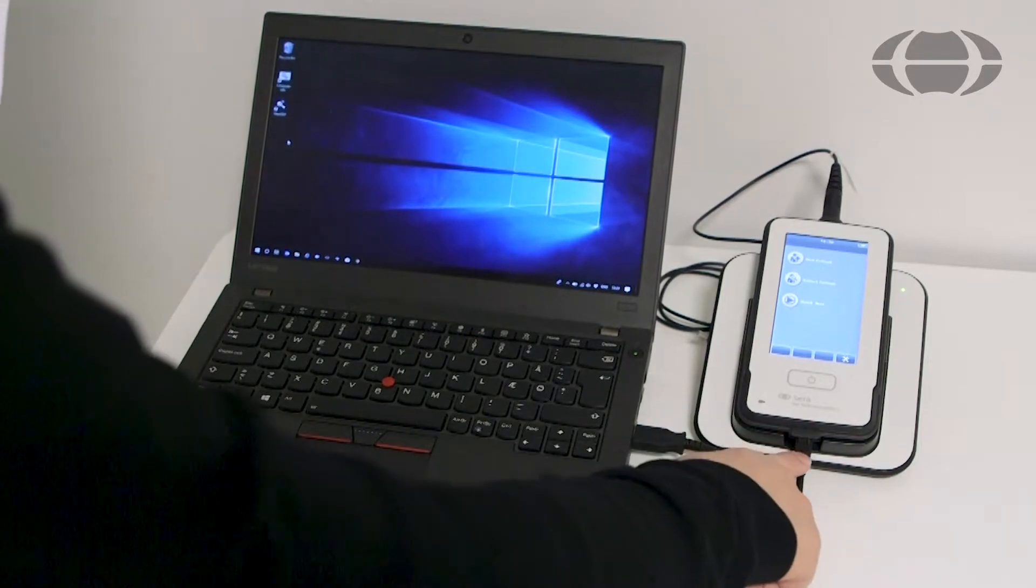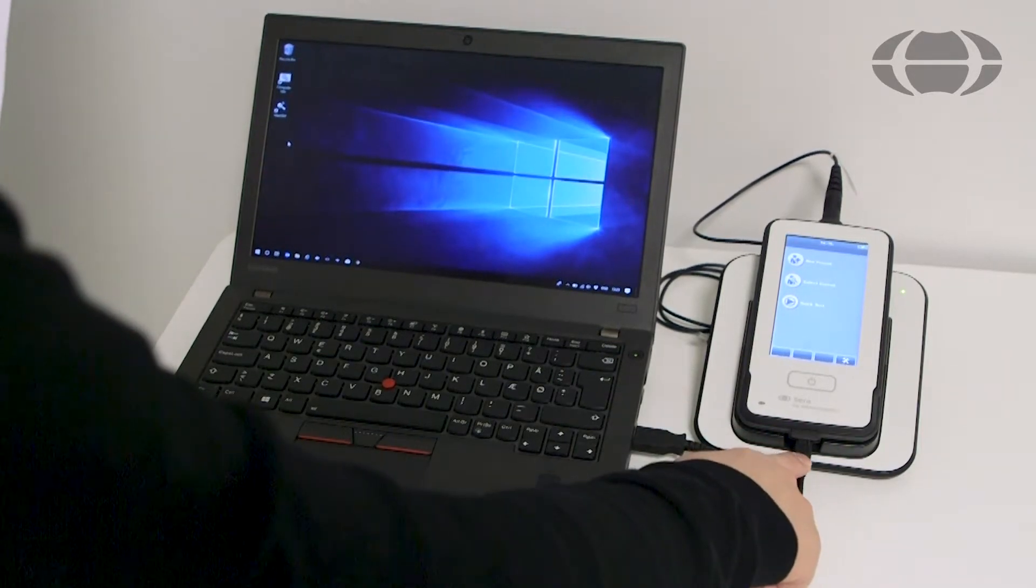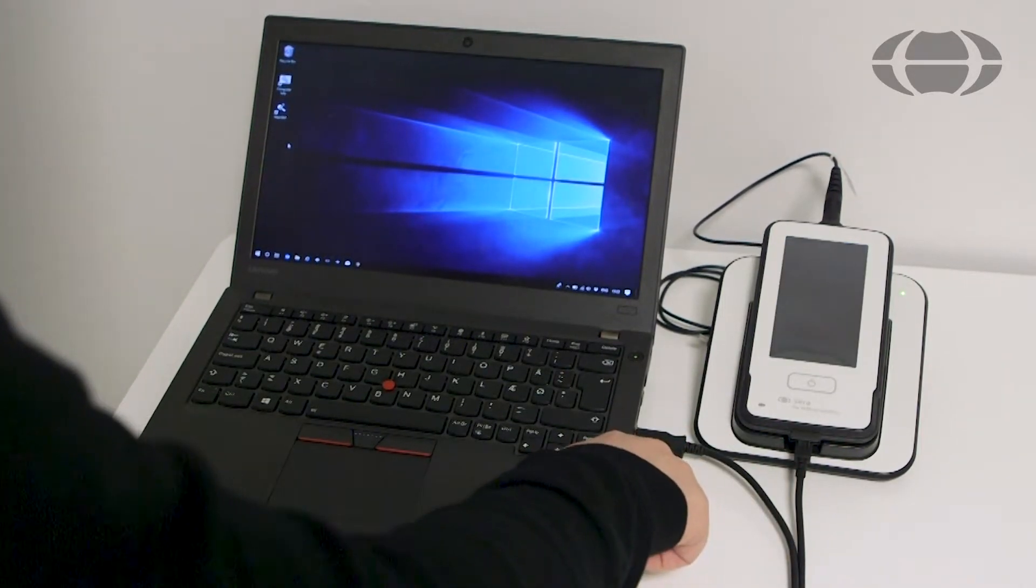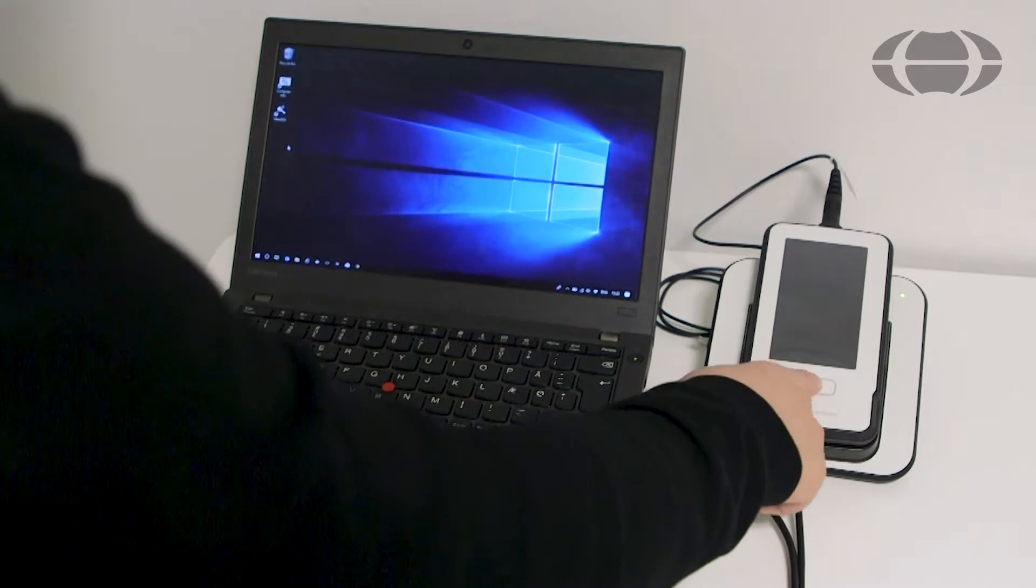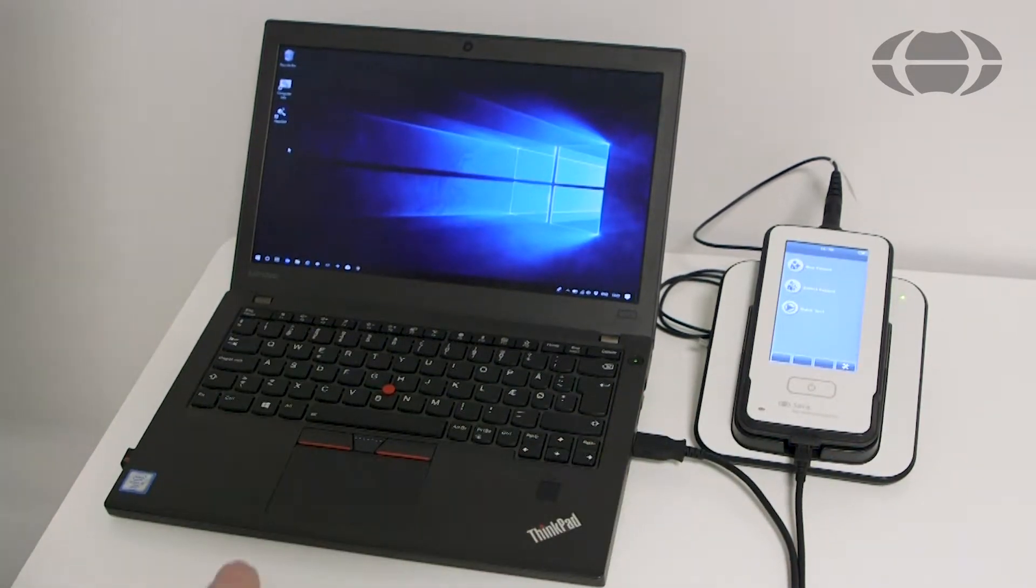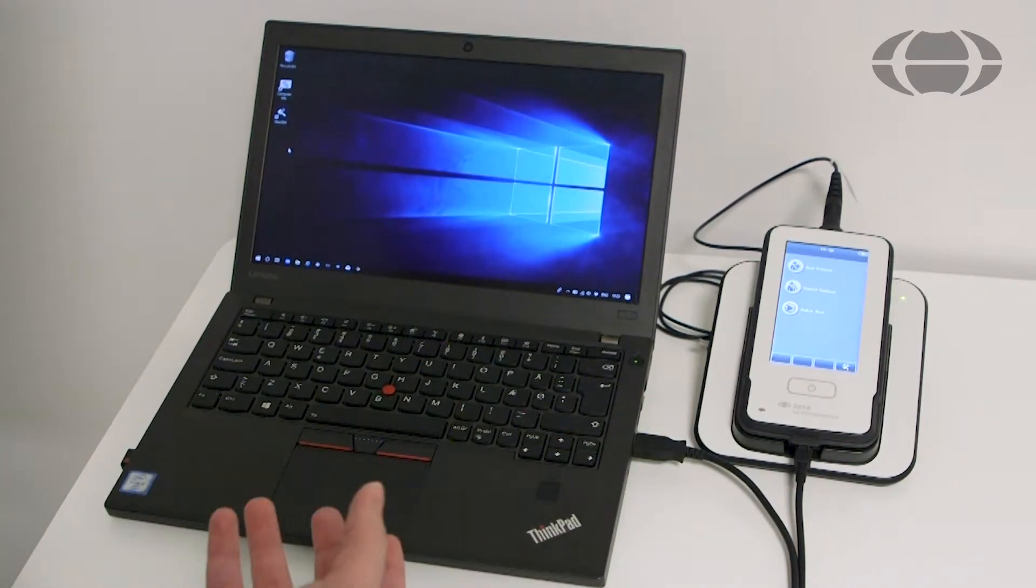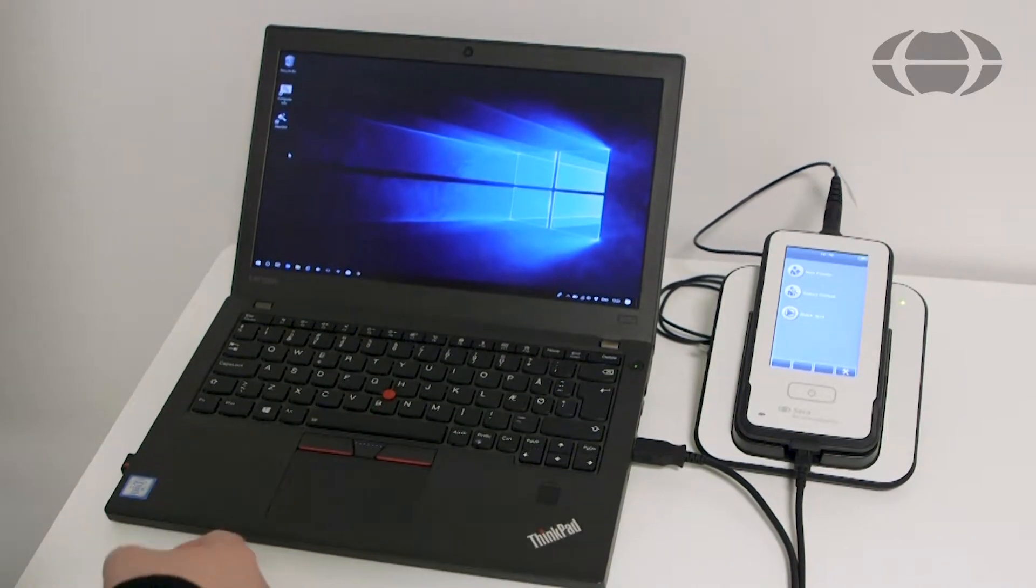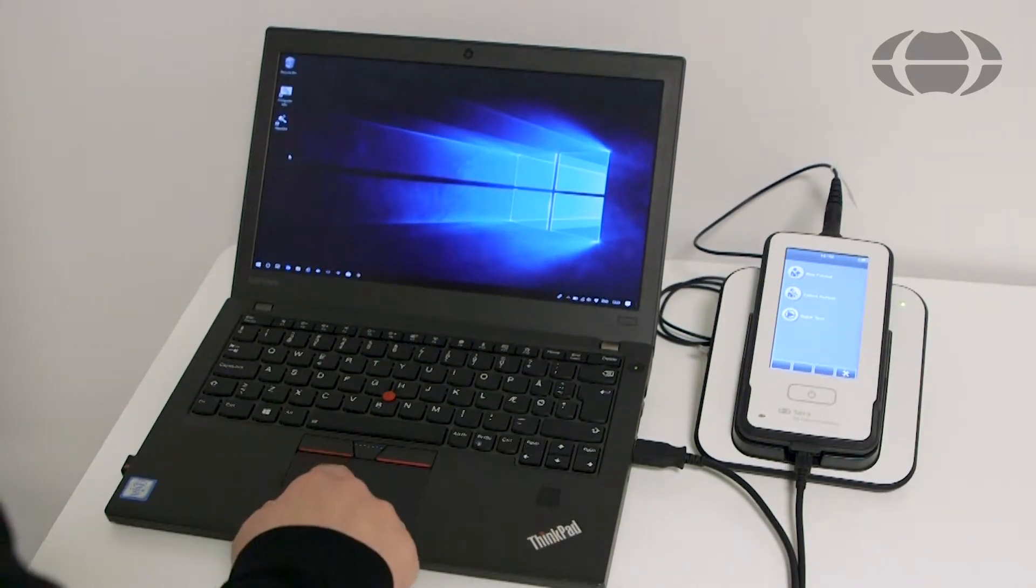Connect the USB cable to both the Sarah and the PC. Ensure that the Sarah is switched on and on the home screen. If you're not on the home screen, the device won't connect properly to the database.